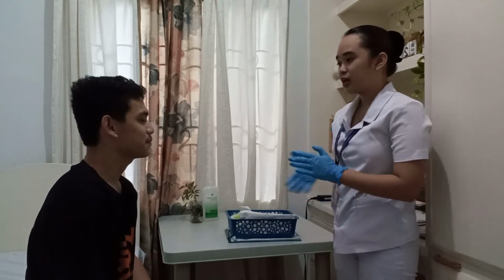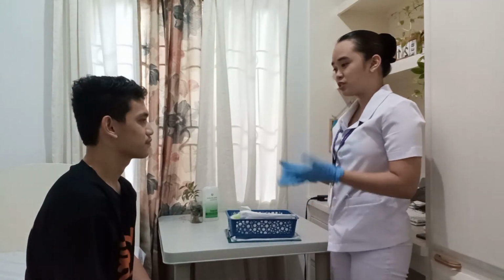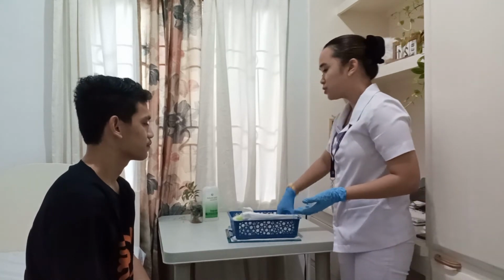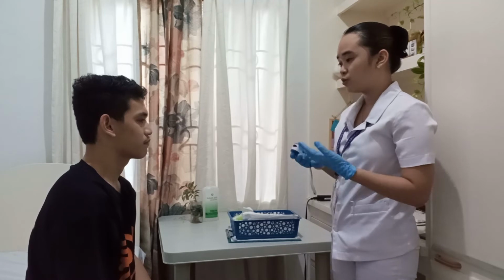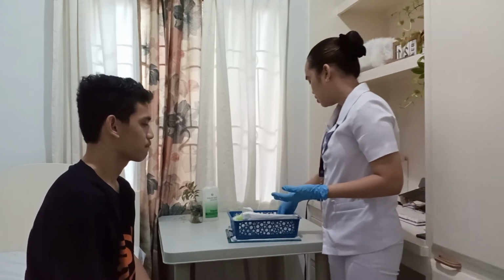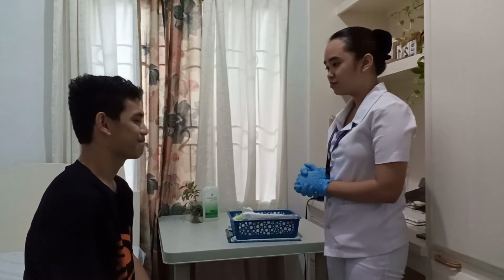Okay, Mr. Patrick, today I'm going to be assessing your oxygen saturation with the help of this pulse oximeter. So this device is used to measure the level of oxygen in your blood. So I just need you to feel at ease and just relax. Would that be alright? Yes, of course.